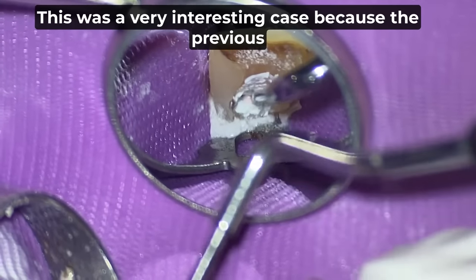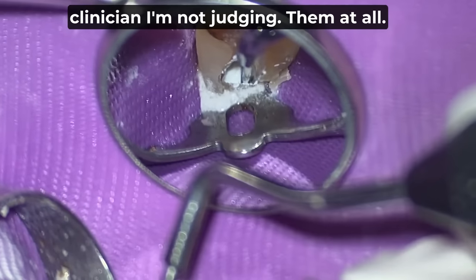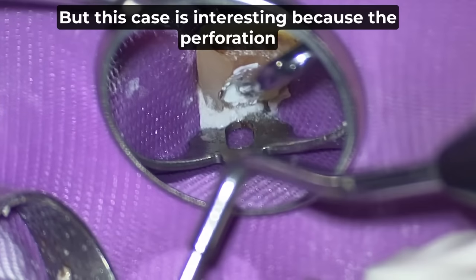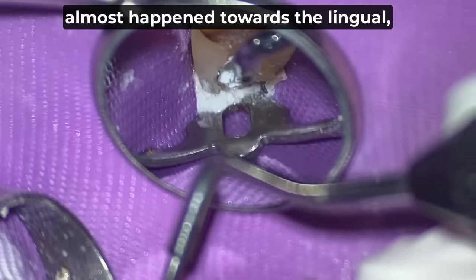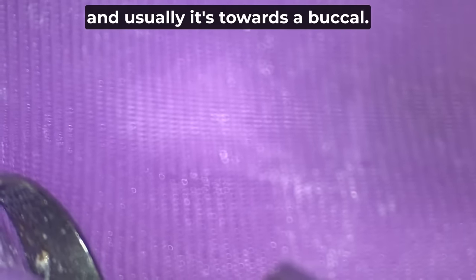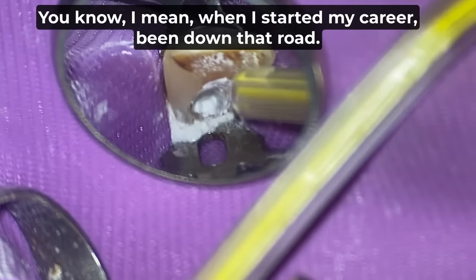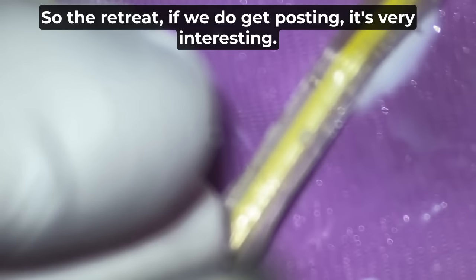This is a very interesting case because the previous clinician, I'm not judging them at all, I've made a lot of mistakes. But this case is interesting because the perforation almost happened towards the lingual, and usually it's towards the buccal. I've almost perforated through the buccal. When I started my career, I've been down that road. So the retreat, if we do get posting it, is very interesting.